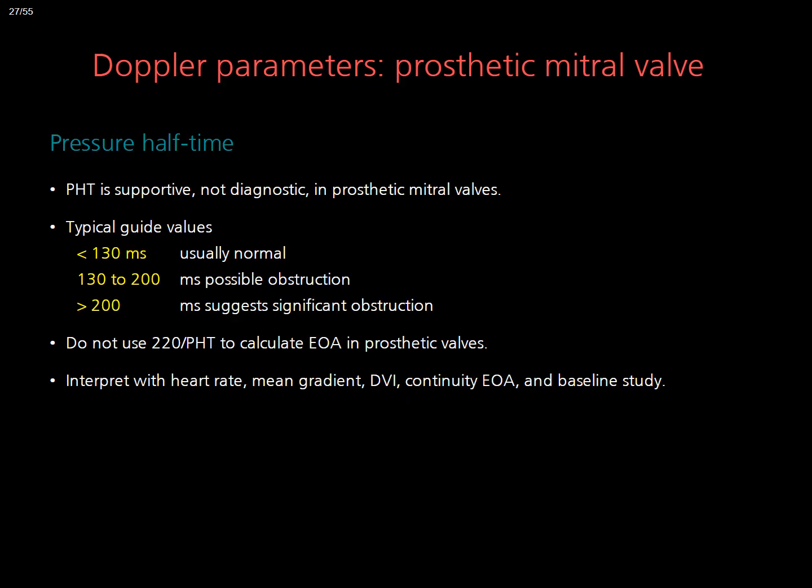That is why the 220 over PHT formula is not valid for estimating valve area in prosthetic mitral valves. So use PHT as a consistency check alongside the mean gradient, DVI, continuity EOA, and the patient's baseline post-operative study.